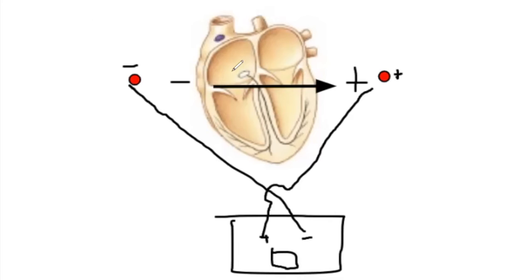So when we have a dipole here, we can also think about the electric field generated by that dipole. We've got a bunch of positive on this side, a bunch of negative on this side, and that field radiates out away from the dipole. Okay, and so when we go to make our measurement, we're doing our positive side minus our negative side. So if the positive side has a higher potential and the negative side has a lower potential, then it's high minus low. That gives us a positive number. That makes sense to everybody? Okay, and what if I flip my leads around? Negative but equal magnitude. Okay, that's very clear to everybody?